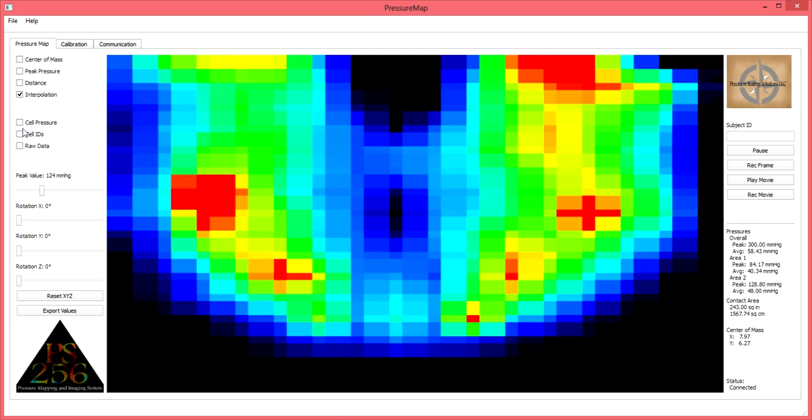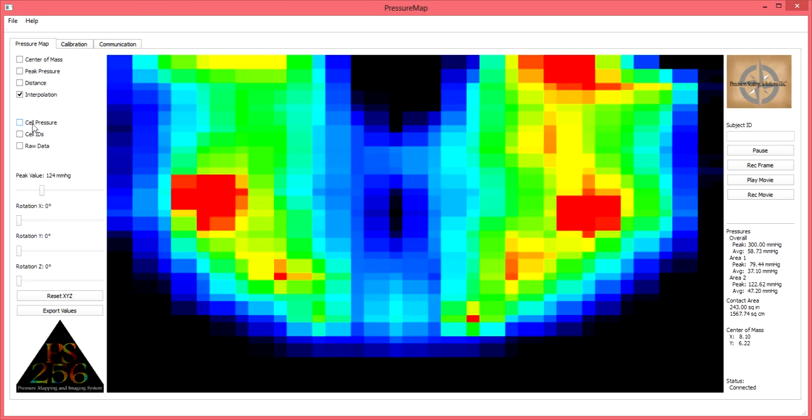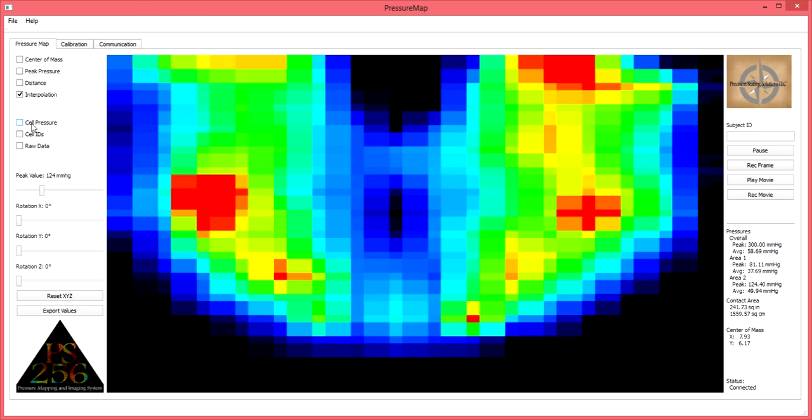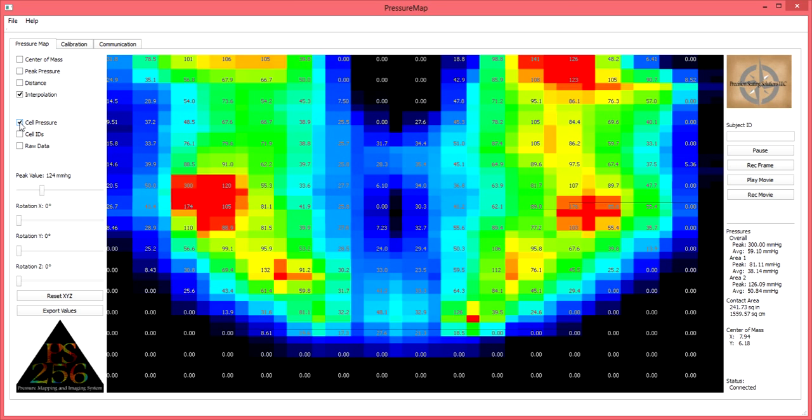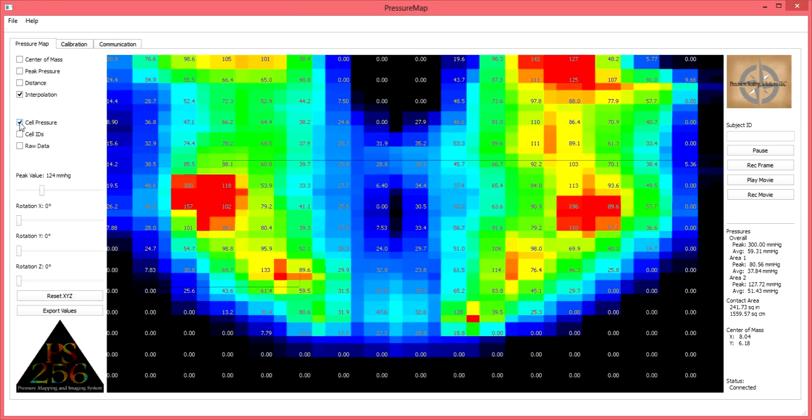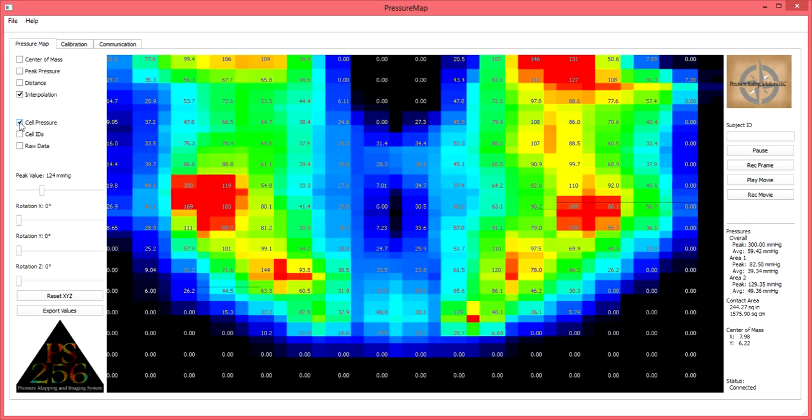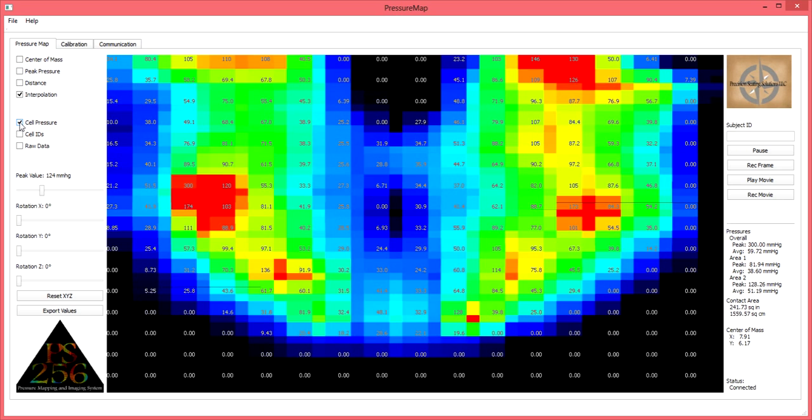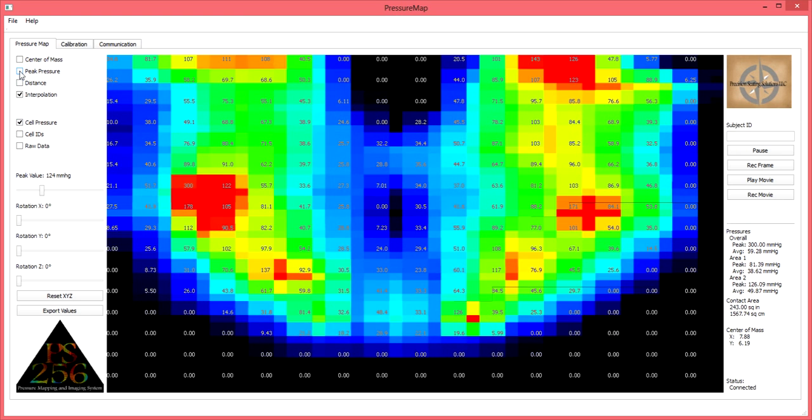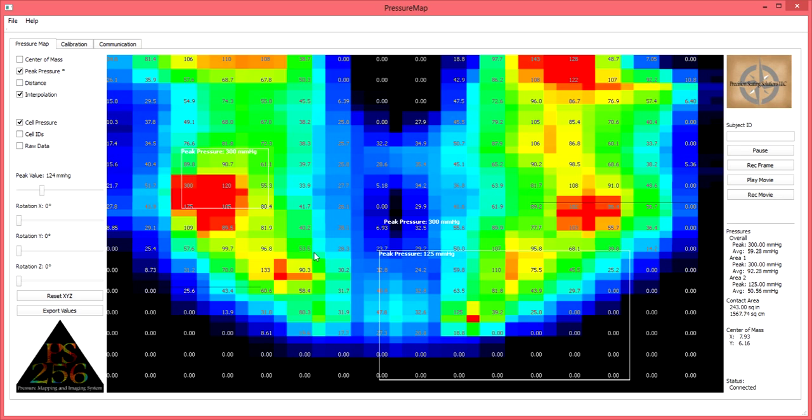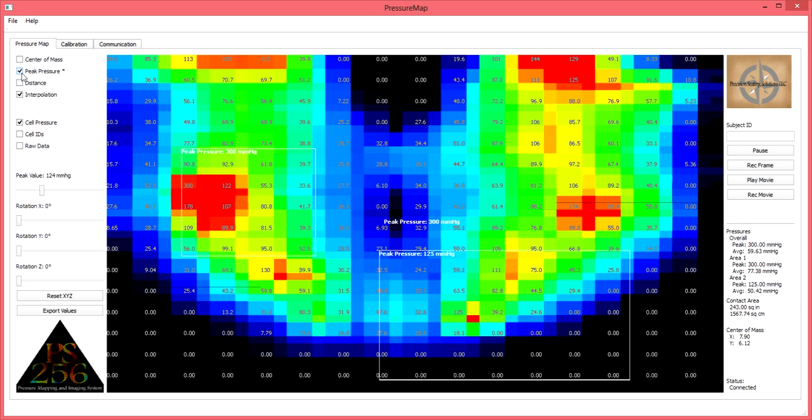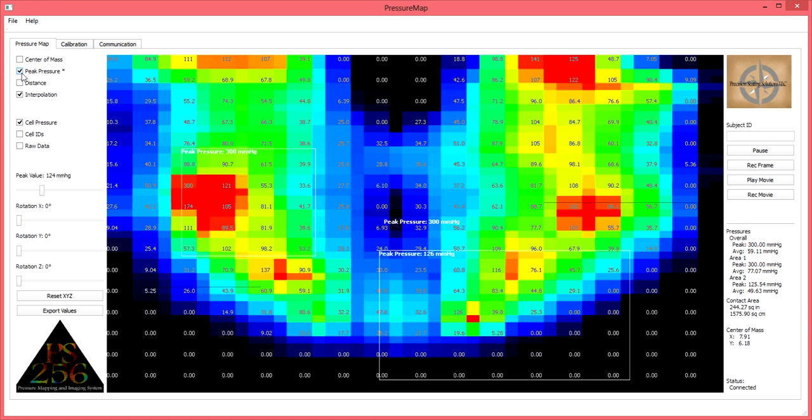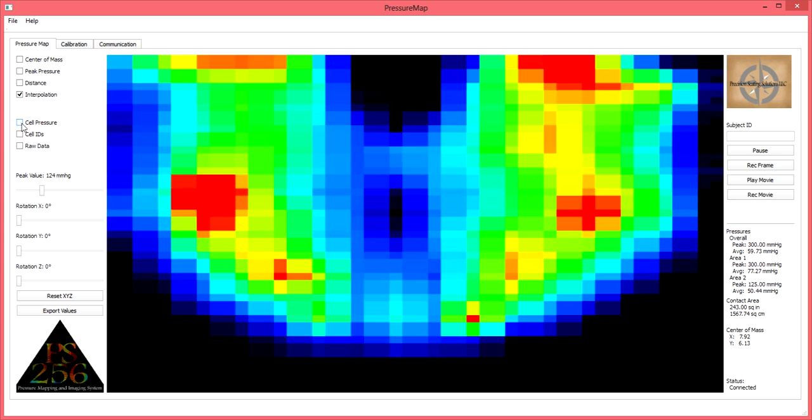If the user would like to know the reading of each individual sensor on a rolling basis, select the box next to the cell pressure selector tool on the left hand side of the screen. This will turn on a feature which will identify the pressure each individual sensor is reading on a continually updating basis. This feature may be used in conjunction with other features we've previously spoken of. To turn off, deselect the box.